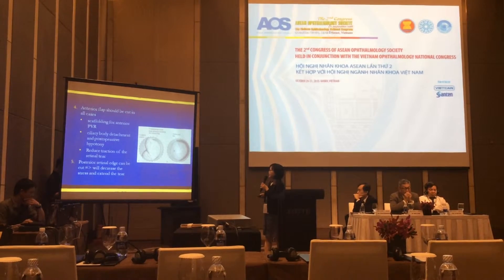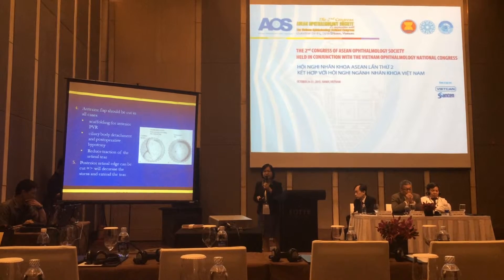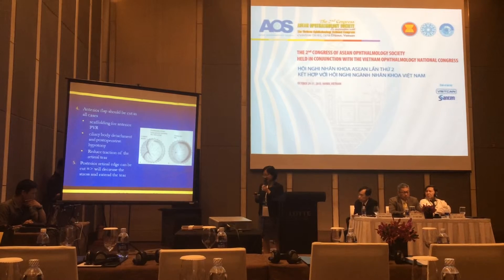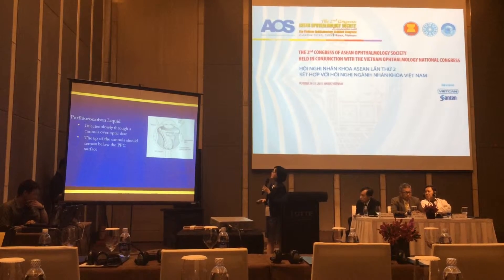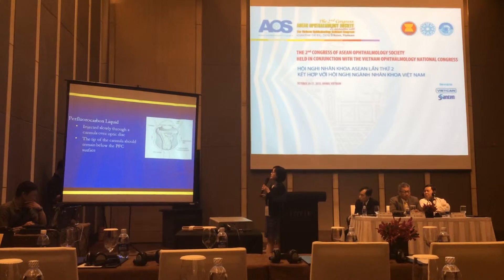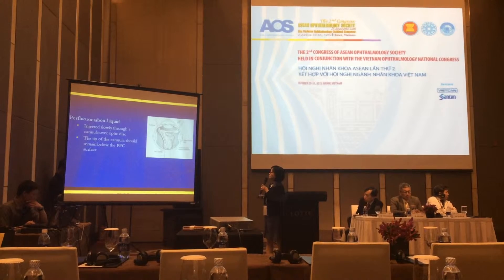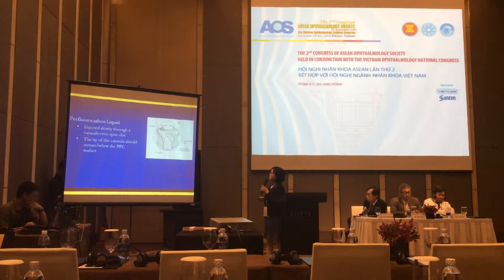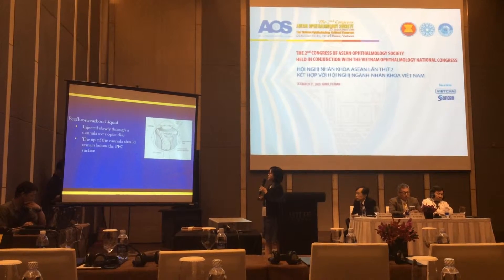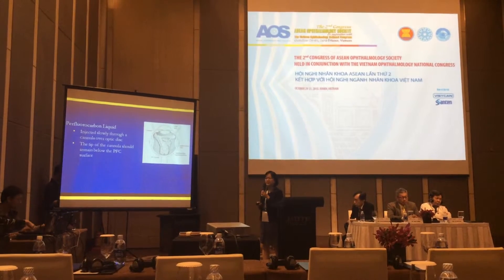The retinal edge may need to be addressed in the presence of proliferative tissue, which will decrease the stress and tension at the tear. After retinotomy, we use PFCL to unfold the inverting flap. We should inject PFCL slowly through a cannula near the optic disc. The tip of the cannula should remain below the PFCL surface.